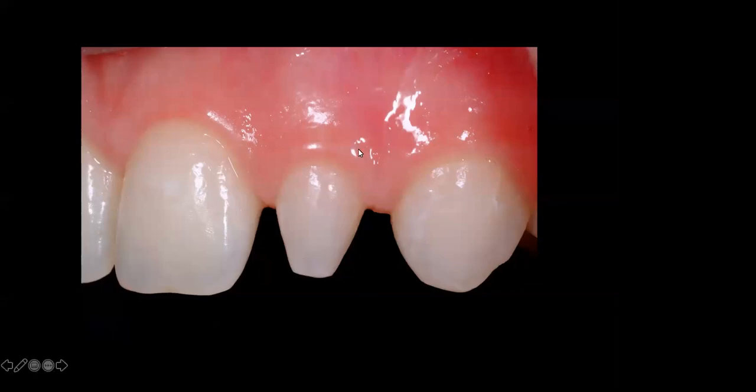Can everyone see this? The distal of this peg lateral, how are you going to close that space aesthetically with just the lateral? Are you sure you don't want to add the canine? Look at that space. It's a big space. That's going to look pretty weird, I think.